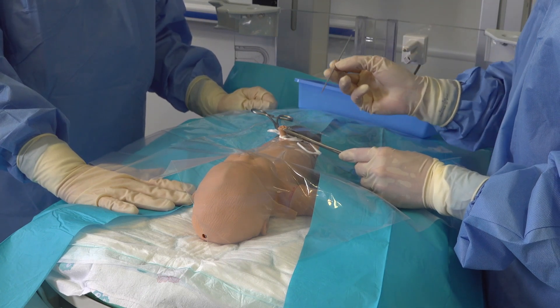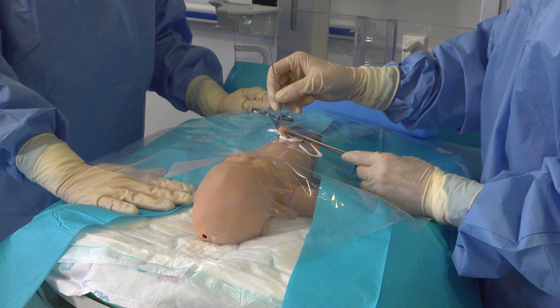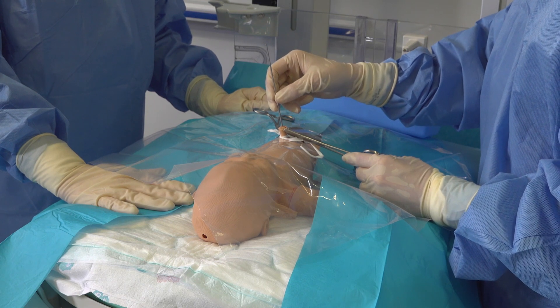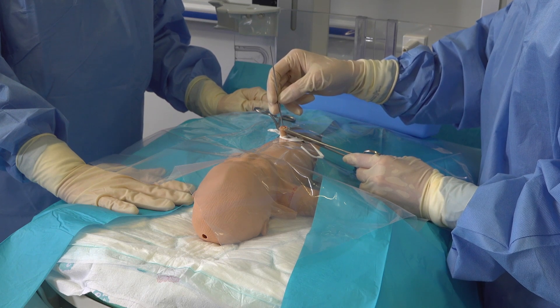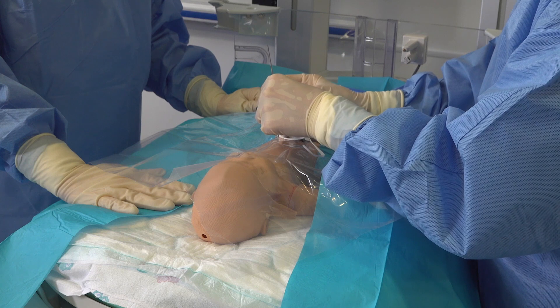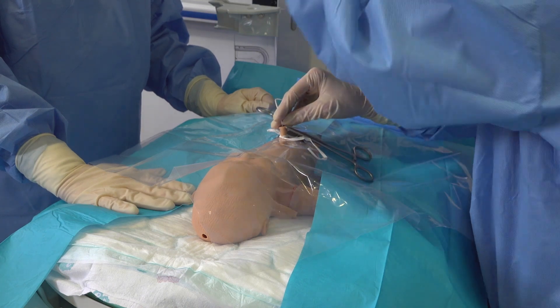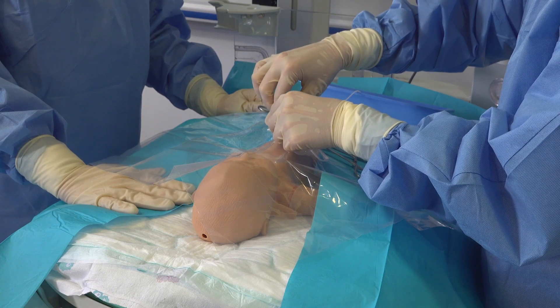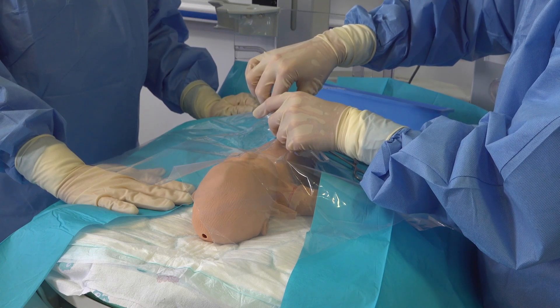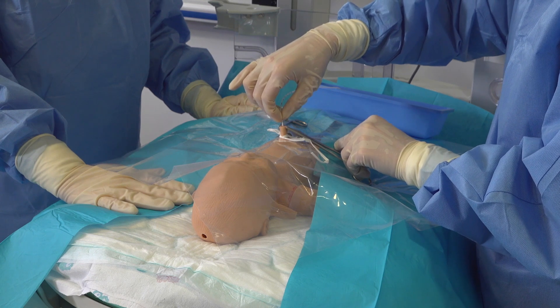When using your dilator be very careful that you use it into your arteries with minimal pressure, just to ensure that you don't create a false passage, and slowly using the weight of it itself just let it drop further down to open up that artery so that you can insert your UAC. Have the tip of your UAC ready for whenever you take out your dilator and can then insert this. You can sometimes feel some slight resistance at the base of the cord when inserting your UAC, but this with a little bit of manipulation generally then passes with ease to the distance that you have measured as discussed previously.